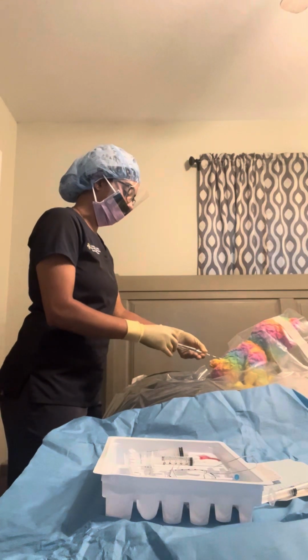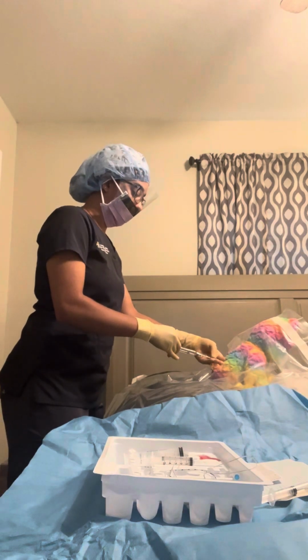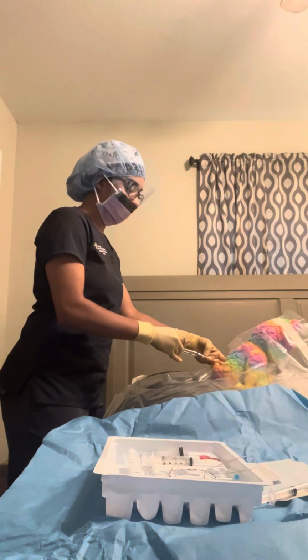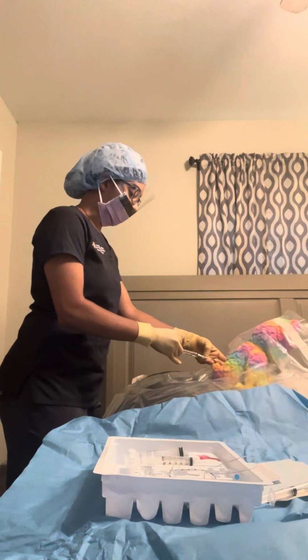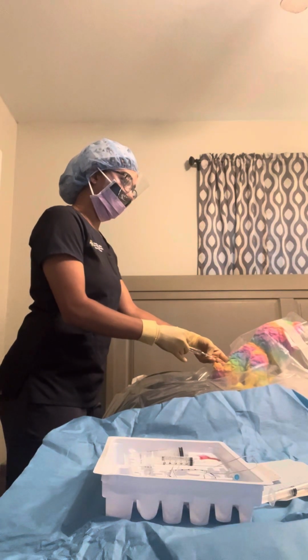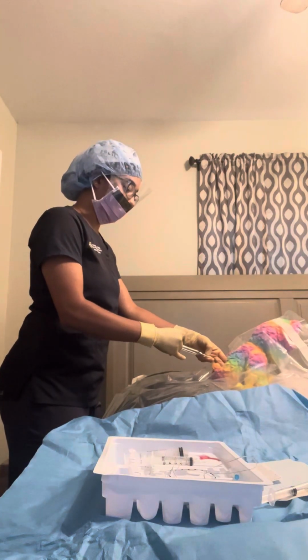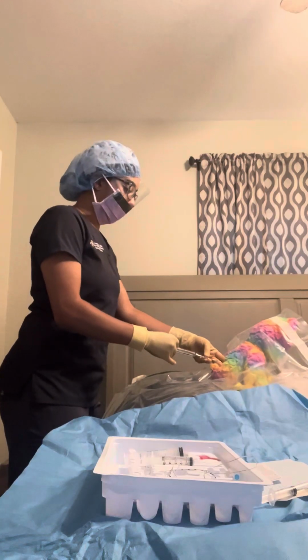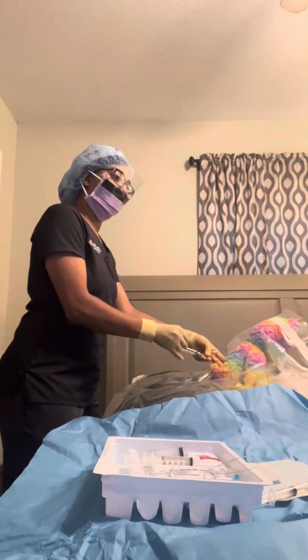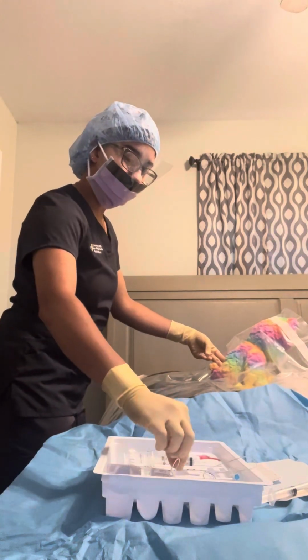to the needle. Now, as I am holding the needle with my non-dominant hand, I will advance the needle slowly while pushing on the plunger with my dominant hand. As I'm advancing, I will advance until I feel the loss of resistance and the needle and the plunger go all the way in. At this point, I will note the depth of the needle, 5 centimeters. I'm going to detach the syringe and thread my epidural catheter in.